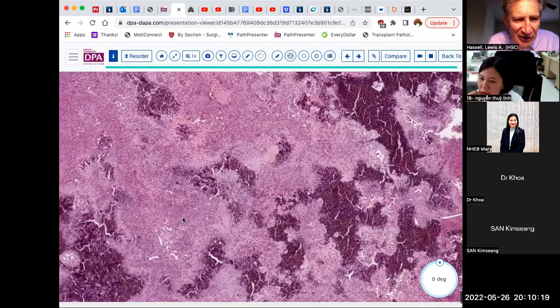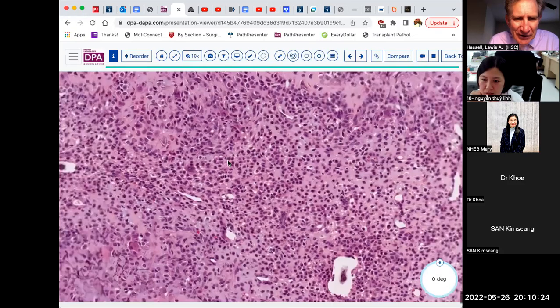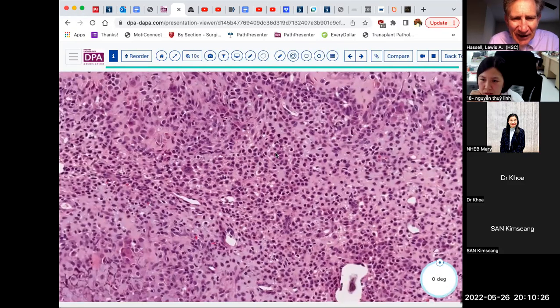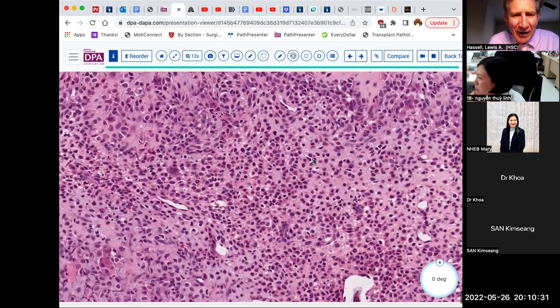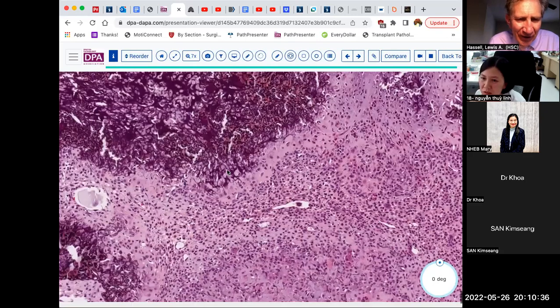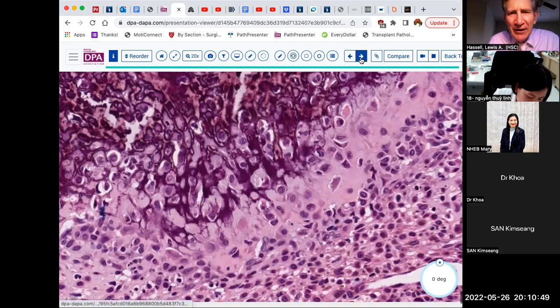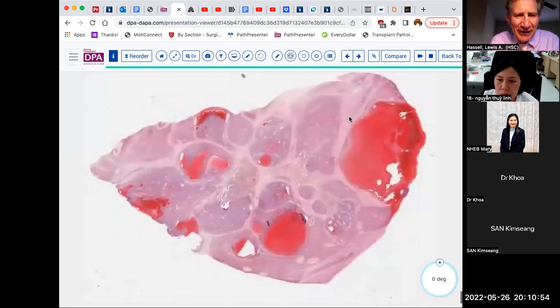This is a chondroblastoma rather than a hepatoblastoma. Although you can see a little bit of the same sort of blastomatous nature to the cells, but this is an out of place slide. And I picked that up based on the calcification pattern, which you see here, which is very characteristic of chondroblastomas, this sort of membranous pattern called chicken wire pattern of calcifications. So my apologies for that, but it makes for a little bit of humor.